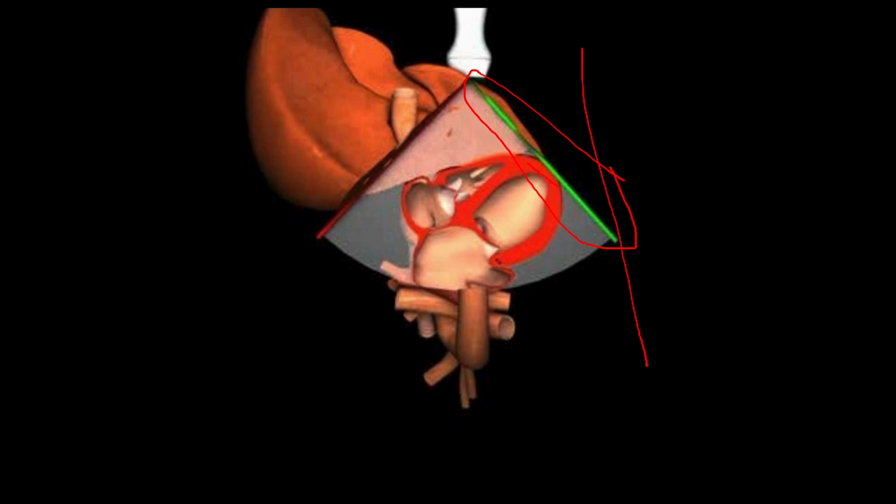And then just remember, if we divide the screen in half, we're going to have what we call the near field. And then posterior to that is going to be the far field. So the field further away from the probe. So in the near field, the closest thing we're going to find to that probe is going to be the liver, because that's where we have the probe, right? So we're using the liver as an acoustic window to help us get those rays across and to the heart.